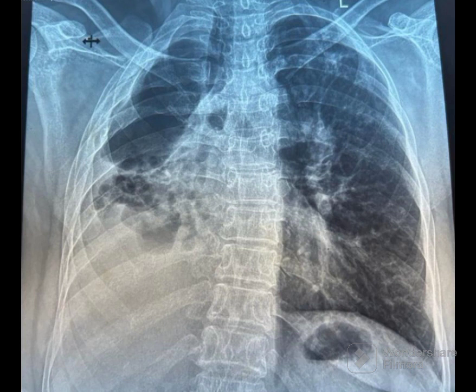Note the large ovoid space devoid of bronchovascular markings in the right apex and upper zone — this is a cavity. Fibrosis and dilatation of bronchi are also noted in the right mid zone, likely bronchiectasis.